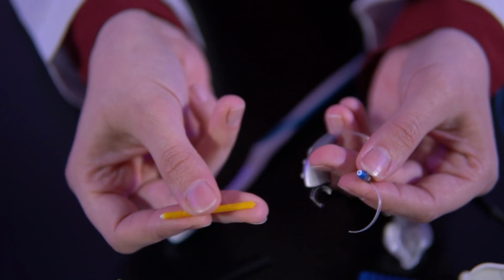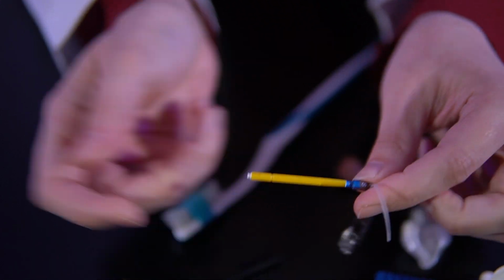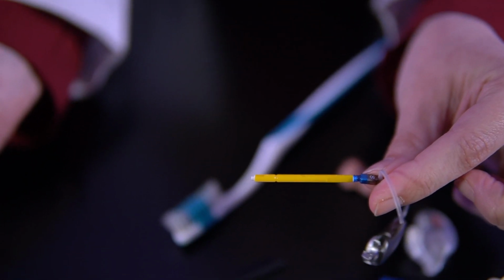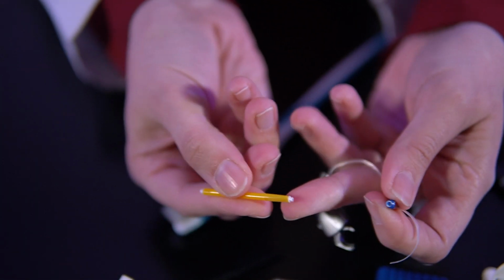So we're gonna take our empty in here. We're gonna pop it in there, okay? See, you don't have to push very hard at all. You just wanna get it in, and we're gonna pull it out, okay?